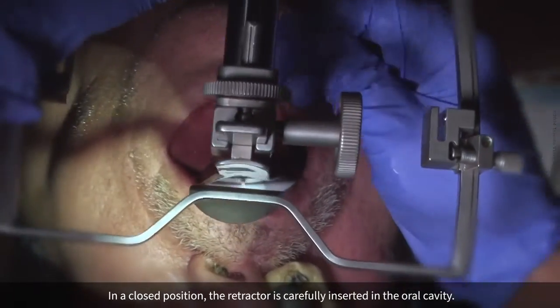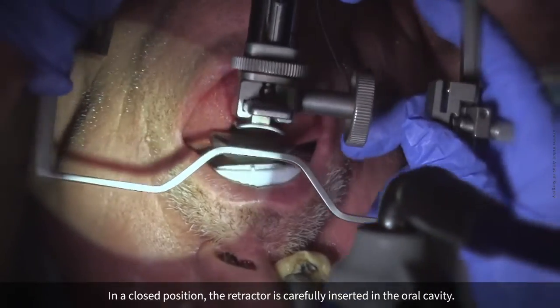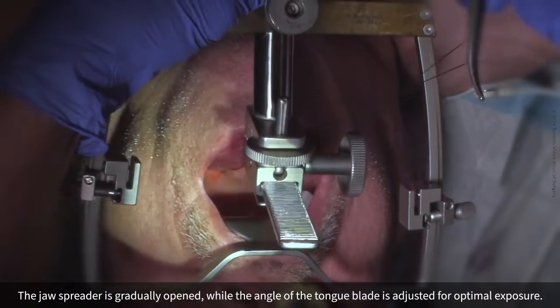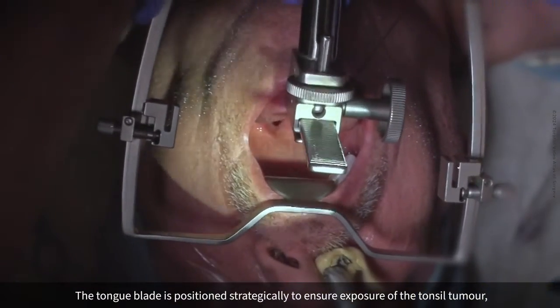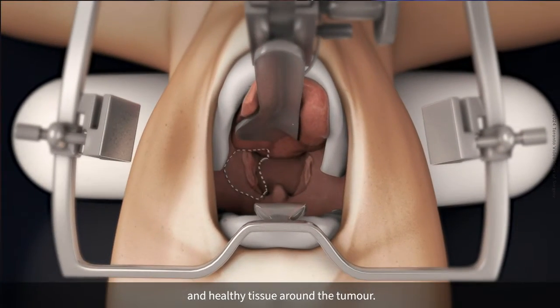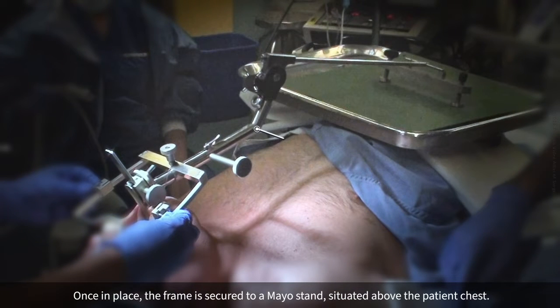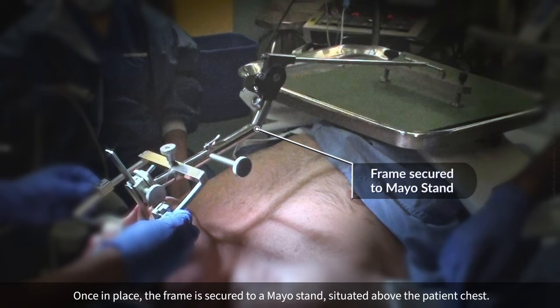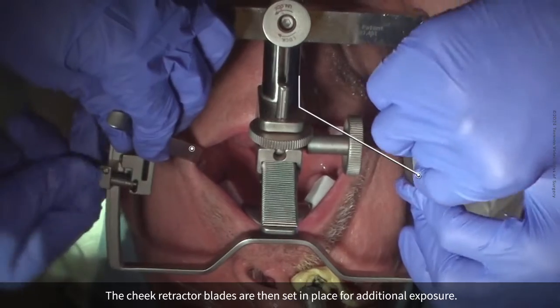In a closed position, the retractor is carefully inserted into the oral cavity. The jaw spreader is gradually opened while the angle of the tongue blade is adjusted for optimal exposure. The tongue blade is positioned strategically to ensure exposure of the tonsil tumor and healthy tissue around the tumor. Once in place, the frame is suspended and secured to a Mayo stand situated above the patient's chest. The cheek retractor blades are then set in place for additional exposure.